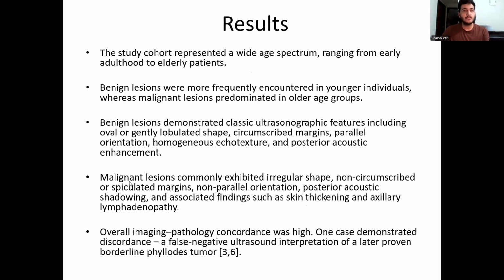The results of this study gave a wide age spectrum ranging from early adulthood to elderly patients. Benign lesions were more frequently encountered in younger individuals, whereas malignant lesions predominated in older age groups.